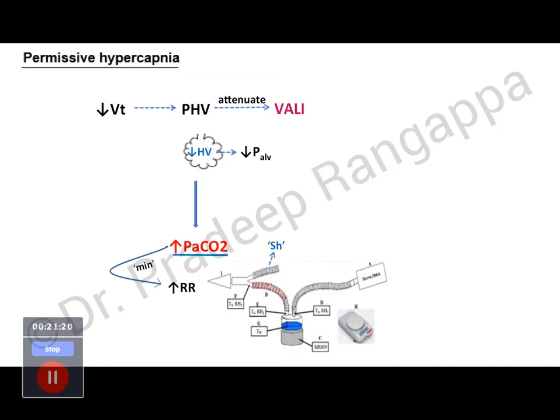And another technical thing, if you're playing with ventilators, is to reduce the dead space. Another important tool to reduce carbon dioxide is reducing the dead space. So you can shorten certain tubings which you use, because those will increase the dead space. Or if the patient has a pleural effusion, you can think of aspirating the pleural effusion to reduce the dead space if you have a huge problem. So reducing the dead space also is another modality where your CO2 can be brought down. So these are the only ways that you can get on the CO2. Increase the respiratory rate, increasing the volume we cannot do, maybe prolonging the inspiratory expiratory ratio, prolonging the expiratory phase may help, and reducing the dead space. These are the only ways we can reduce CO2.